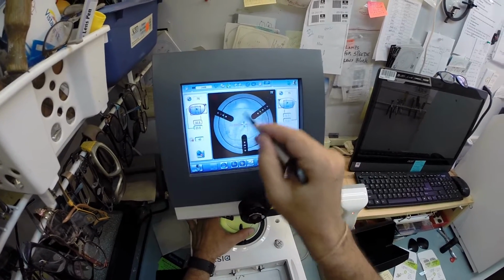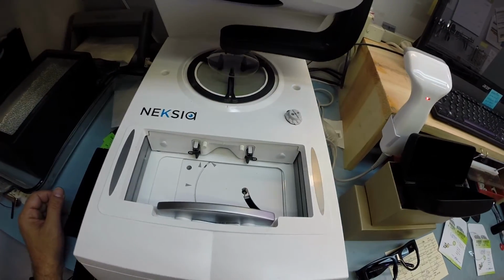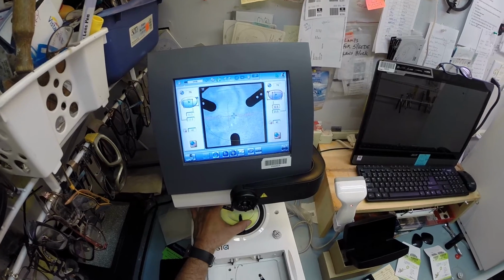As long as it's large enough to cover that, it will go in there. I'm going to hit that button. The arm's going to come down and place the block onto the right lens. Of course, this could be the left lens. It really doesn't matter since these are non-prescription. But the first lens. I'm going to go ahead and put the second lens there.